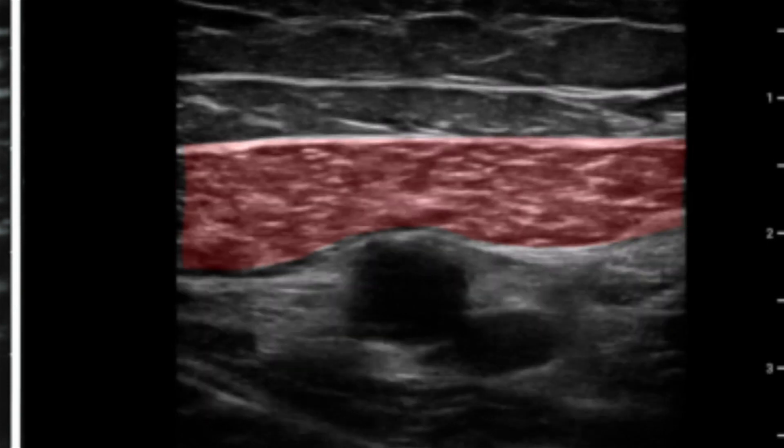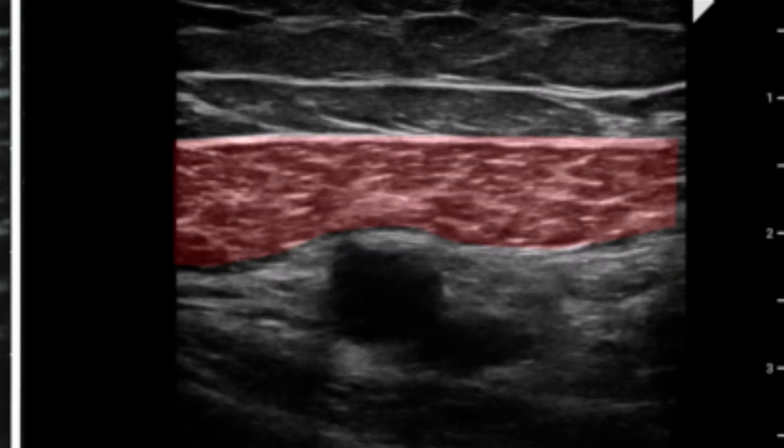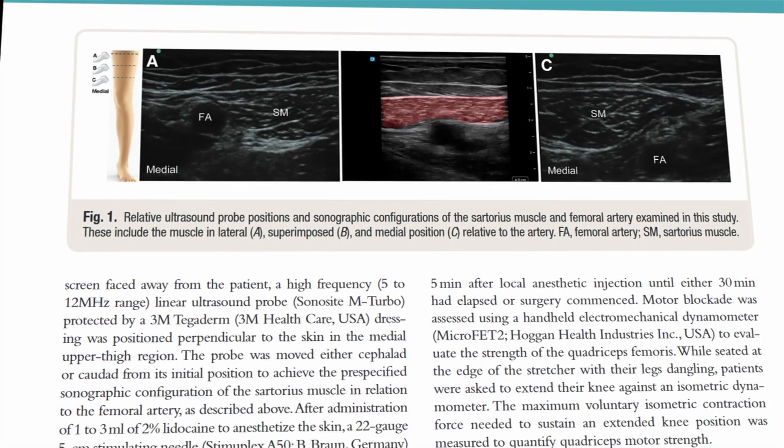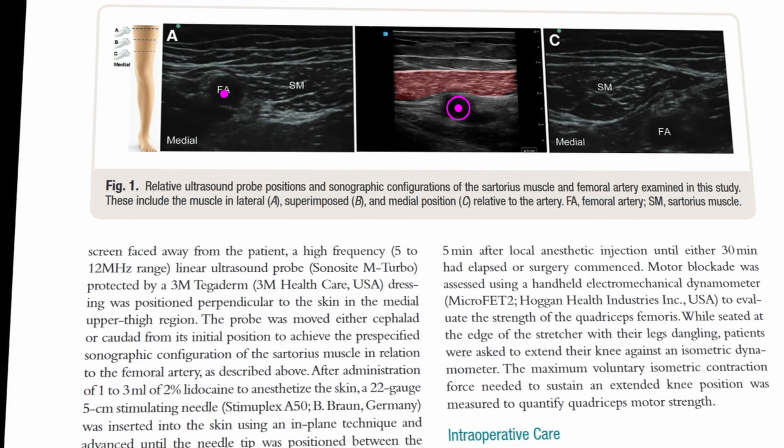The next way of doing it, and some studies do this, is they look at the sartorius — which is what we can see on screen here — and they look at the relationship between the artery and the sartorius. So whether the artery is on this side, the middle, or on this side, and they use that to differentiate.